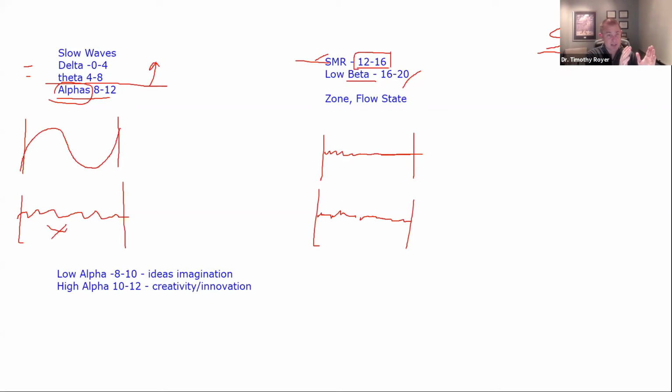So we know that's done. What you're doing today in your centers with every client is you're applying the exact same principle with neurofeedback: you're changing brainwave activity with operant conditioning. You're just not feeding them M&Ms or milk. You're feeding them something they want to engage in, like a video task.